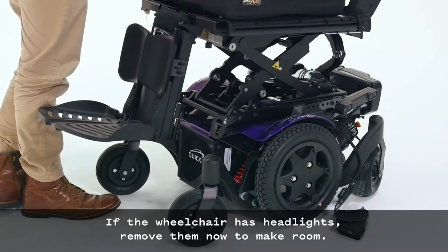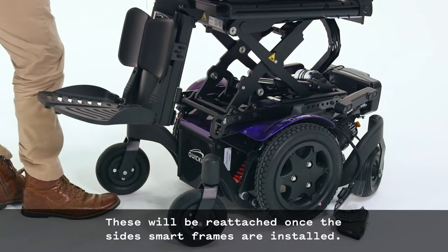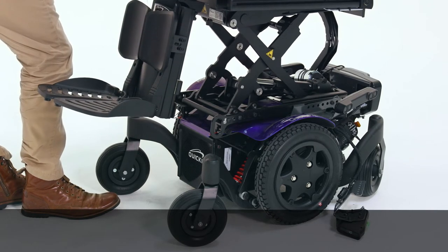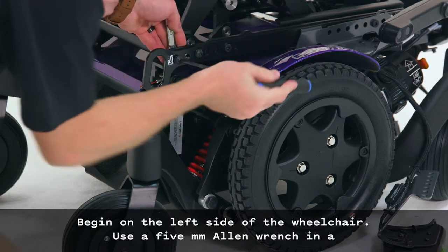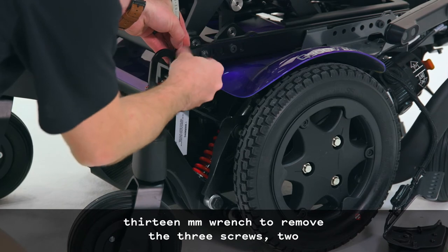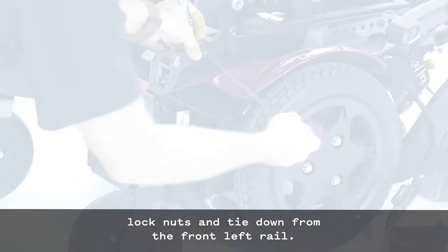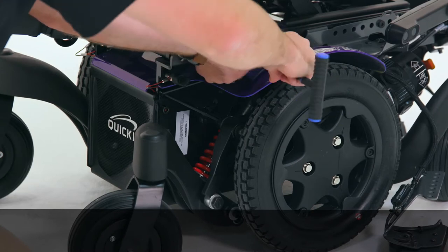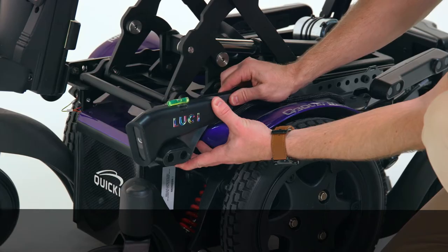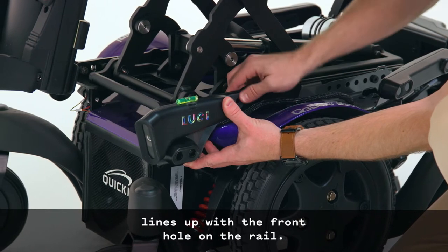If the wheelchair has headlights, remove them now to make room — these will be reattached once the side smart frames are installed. Begin on the left side of the wheelchair. Use a 5mm Allen wrench and a 13mm wrench to remove the three screws, two lock nuts, and tie down from the front left rail. Place the left smart frame so that the front hole of the bracket lines up with the front hole on the rail.